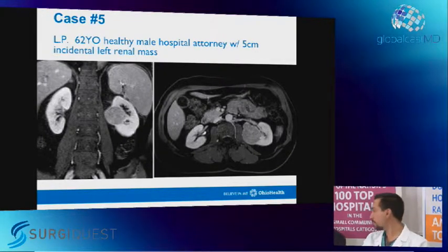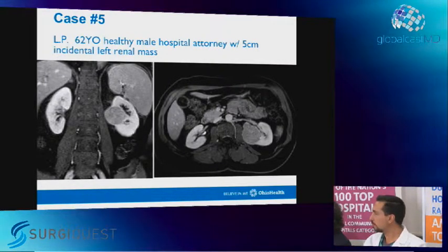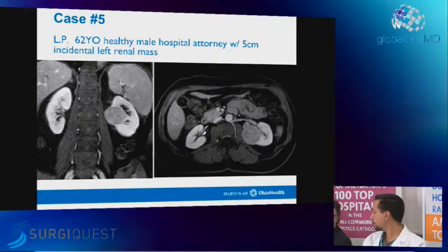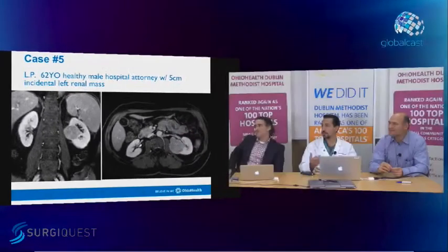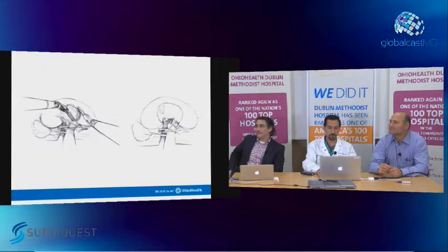Yep. So other things you think about? Did you use your deep suture on this one? No, we didn't. But other considerations, Lee, when you see a tumor like this, are there other things that you're thinking about? So complete vascular control, kind of getting that plane, that hilar plane, done ahead of time. To be honest with you, the concern is more about your repair. That's reconstruction. Yeah, agree. So that's the main challenge, is once you're done, you know, the reconstruction is a little bit more challenging because you don't want to knock off any major vessels.